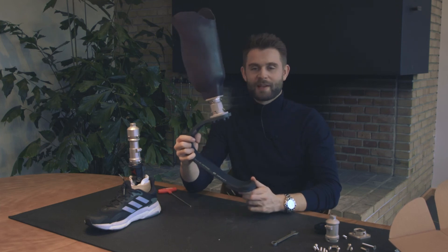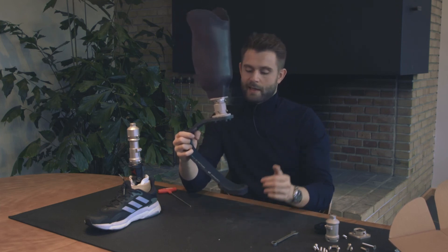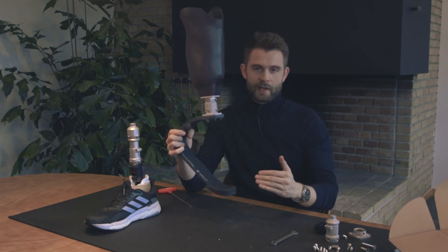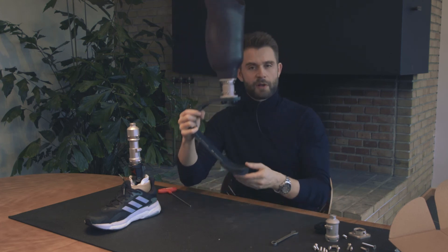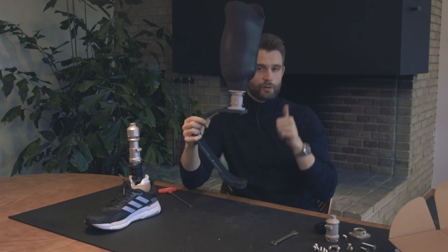Your setup should now look something like this. It's important that you just play around with the settings when you go on your first run in order to figure out what is actually right for you. But if it looks something like this, you're almost there.